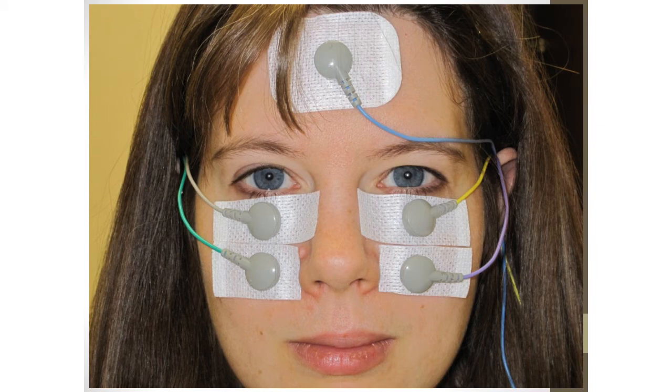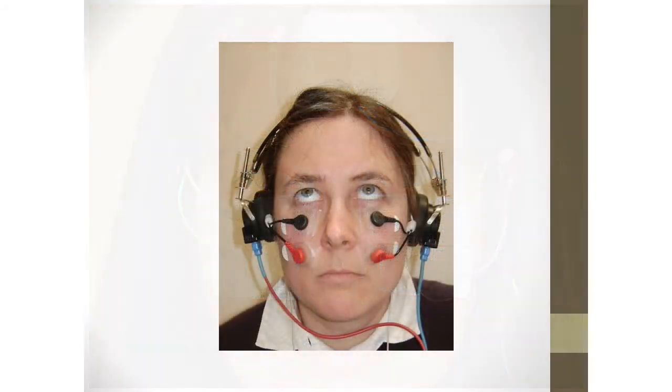Right? You can do it with a two-channel system or a one-channel system. With a two-channel system, you don't have to change electrodes or plug in different electrodes when you change ears. But those muscles, those are the muscles you're actually collecting this from. I get this one as close as I can to the eye, and this one as close as I can to this electrode without touching it. And then during the test, the patient is looking up. We actually give them a target on the ceiling, and they have to keep their eyes on it during the test.